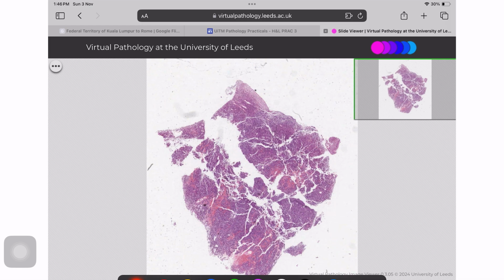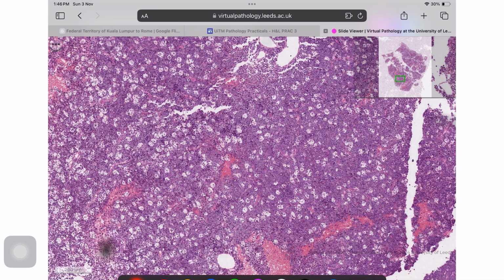The next one is on Burkitt's lymphoma. So you just need to zoom into this area, and when you zoom into this area, you can actually see there's a lot of proliferation of these lymphoid cells, and this lymphoid cells is what we call as the sky blue, which color almost like a black sky, but there's lots of this whitish area that looking like a star. So this is the one that gives rise to starry sky appearance, right?